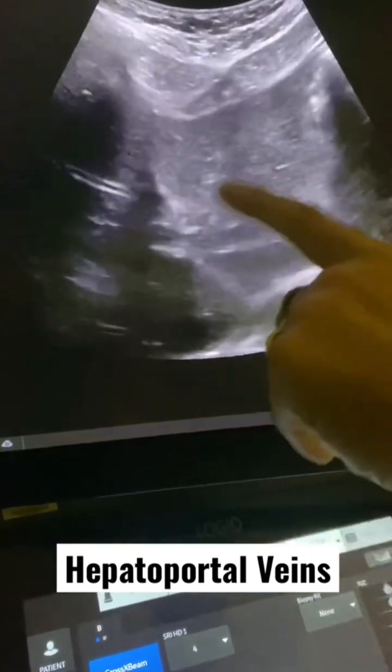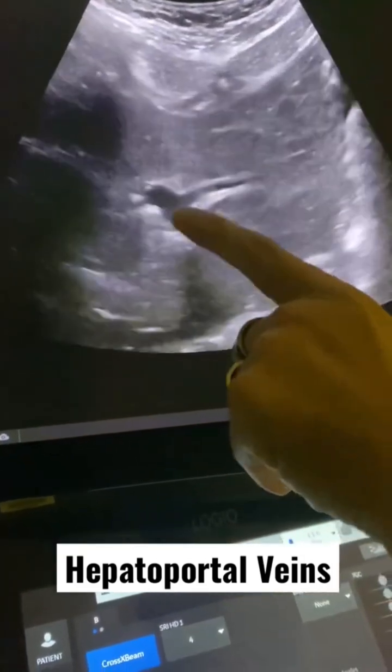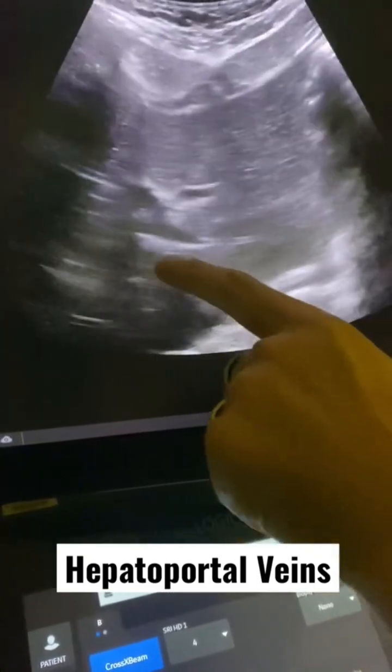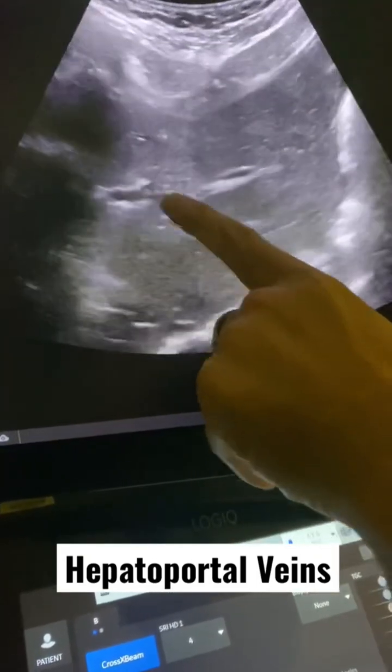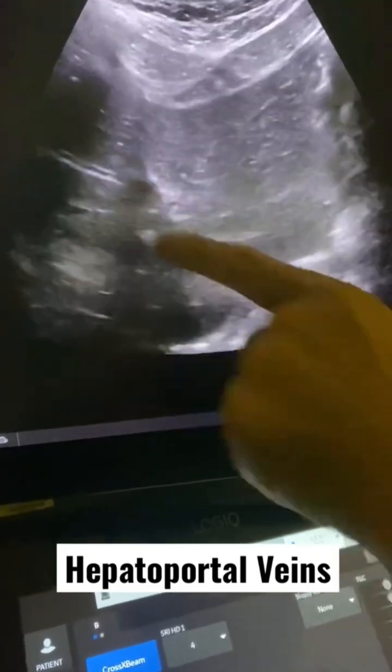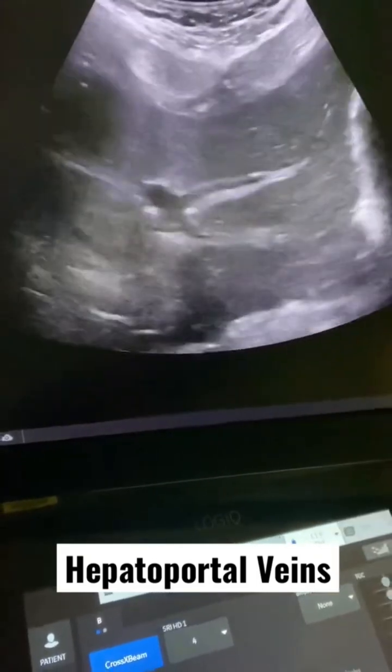This is a branch going to liver segment 2, liver segment 3, and then over here these branches go to liver segment 4.